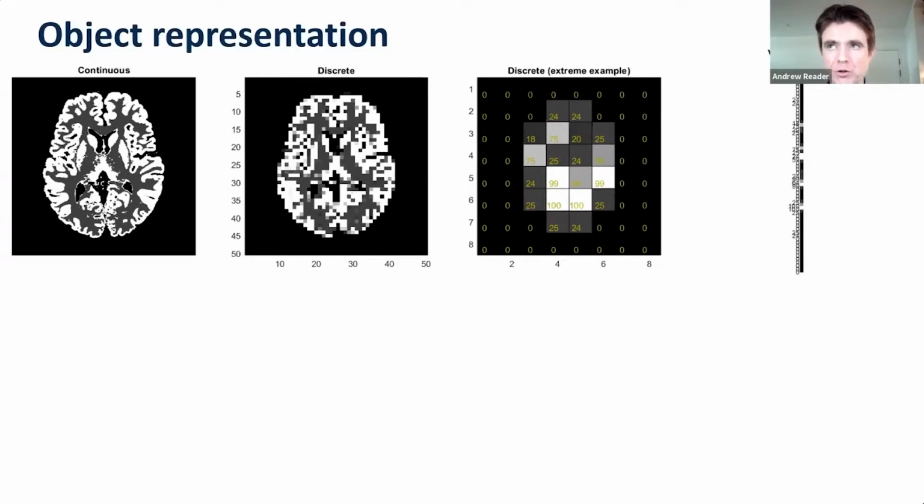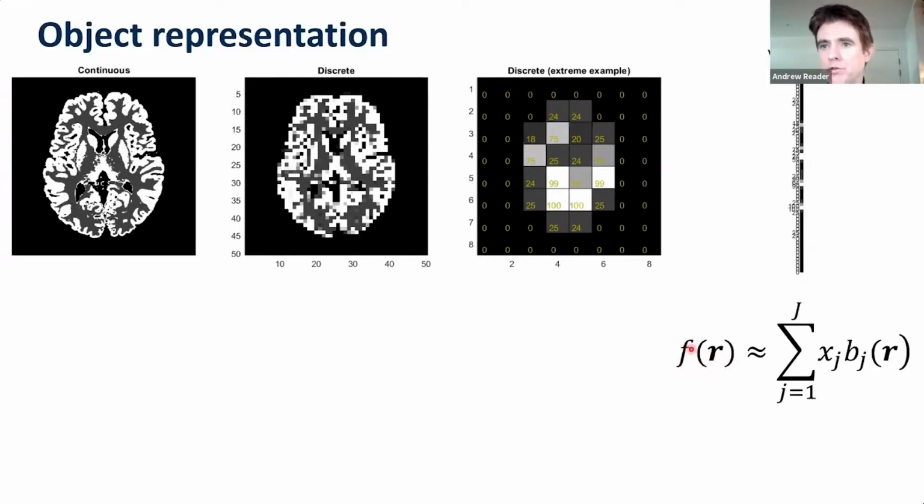And so iterative reconstruction is all about finding X, which is a representation of that continuous object. To be explicit about that, the continuous object, whether it's a radiotracer distribution, or an MR net transverse magnetization, or a mu map for CT, we're saying it's approximately equal to a set of basis functions, and I'll be assuming pixels or voxels throughout this presentation.